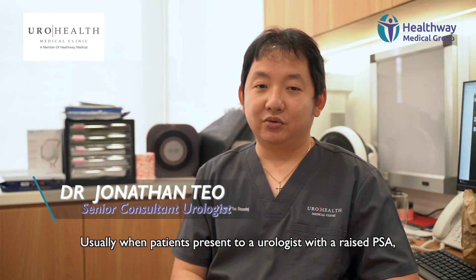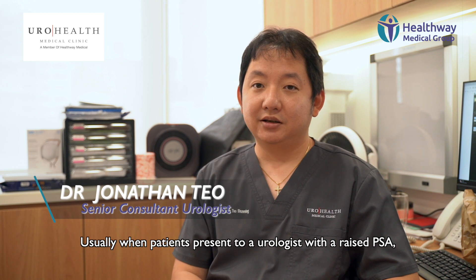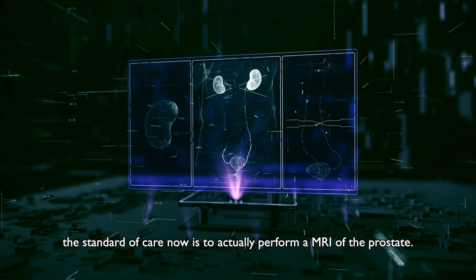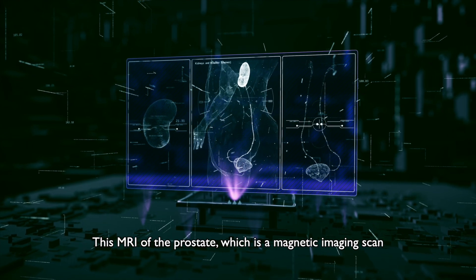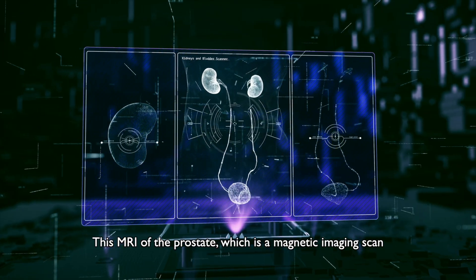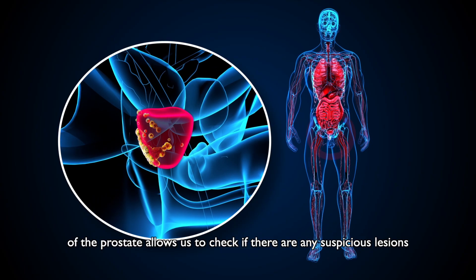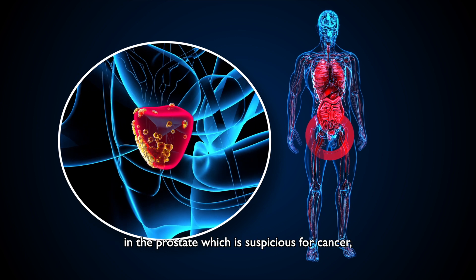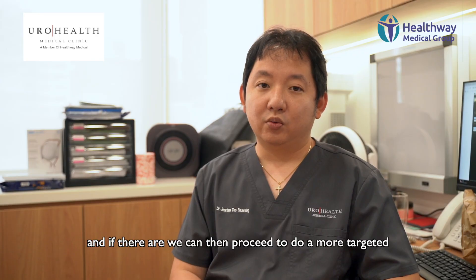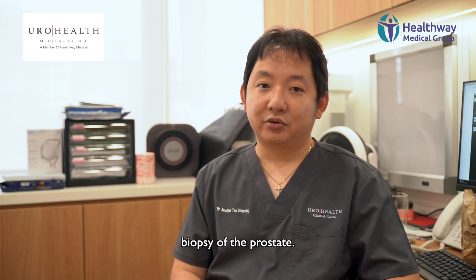Usually when patients present to a urologist with a raised PSA, the standard of care now is to perform an MRI of the prostate. This MRI, which is a magnetic imaging scan of the prostate, allows us to check if there are any suspicious lesions in the prostate suspicious for cancer, and if there are, we can then proceed to do a more targeted biopsy of the prostate.